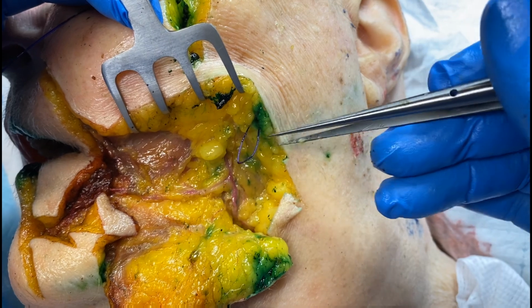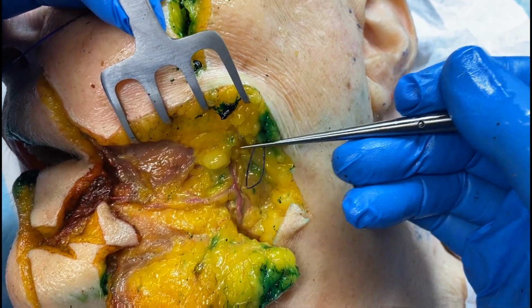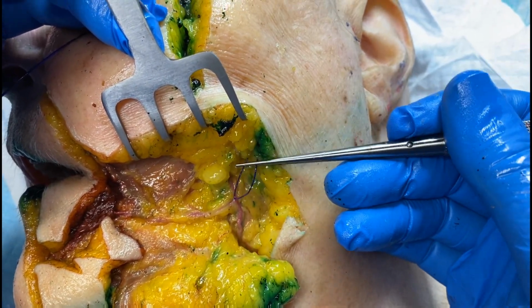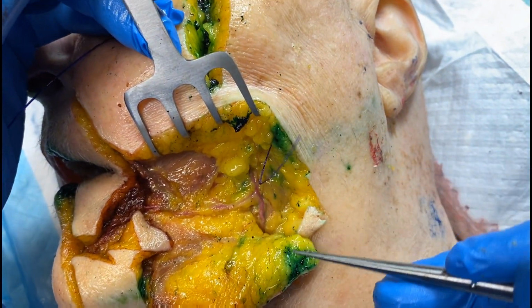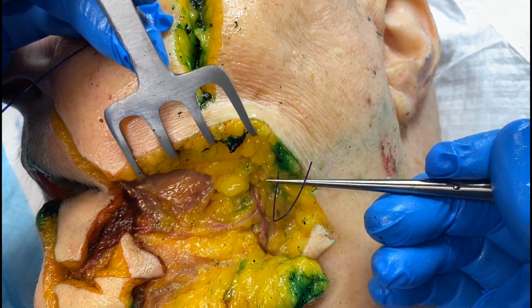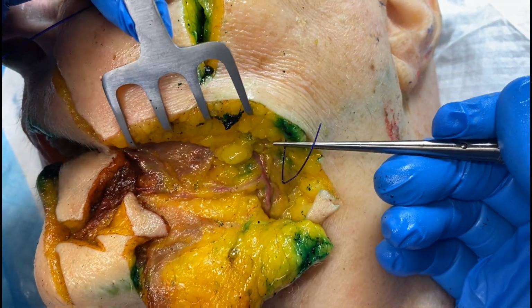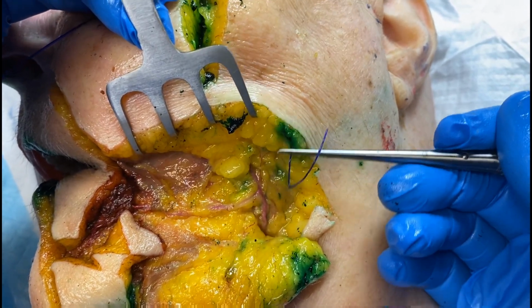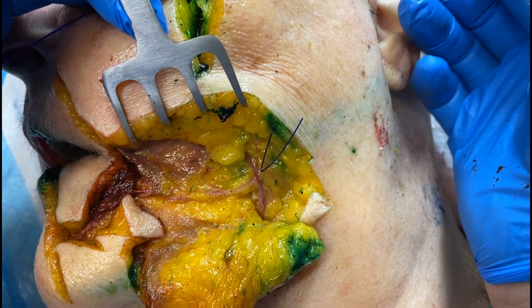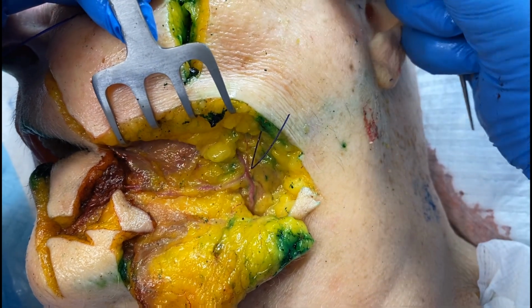That's that butter that you get into. A cannula flows through it real easily till you get down into this region. But so all the barbs on these threads are really attaching to which plane? They're attaching into the fibrous part of this superficial fat. So they're caught in the fibers of the superficial fat. That's what's maintaining that lift there.